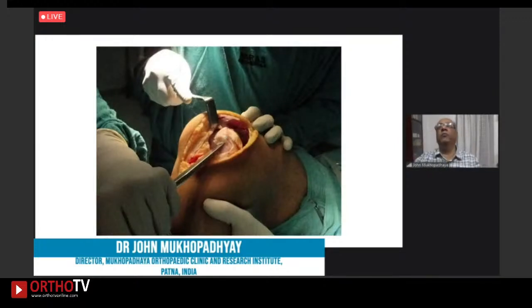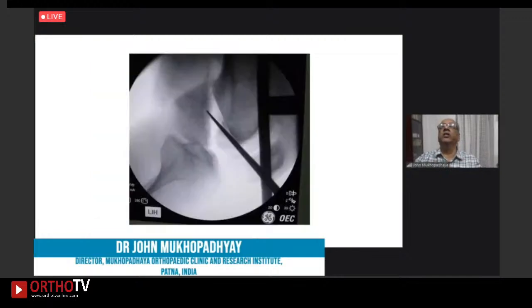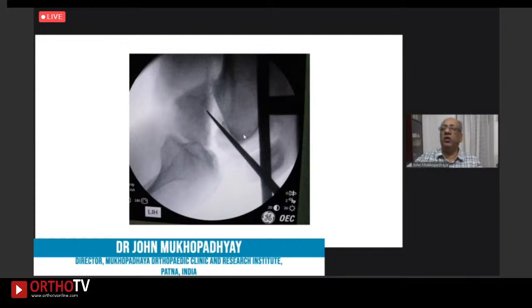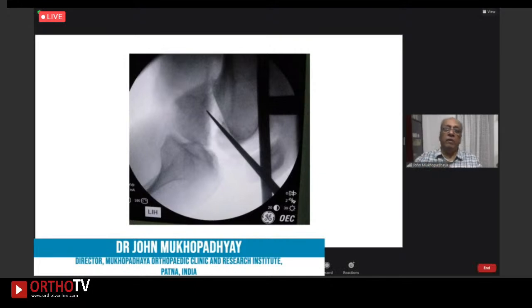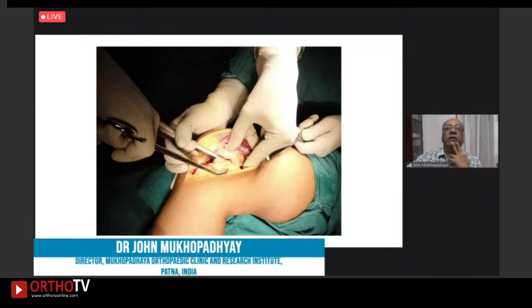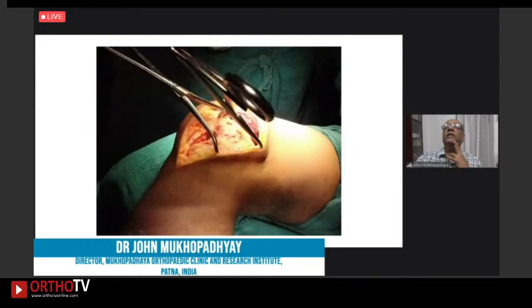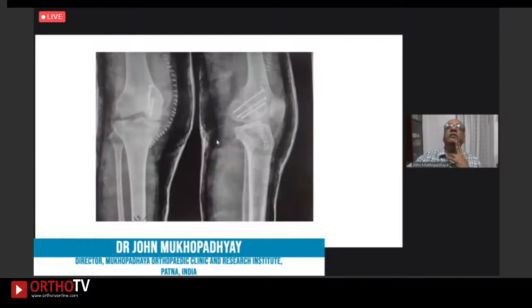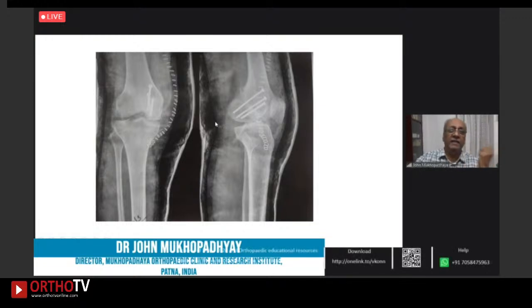An osteotomy was performed through the fracture line. A wedge of callus and fibrous tissue was taken out. Getting the fragment back to its original position was not easy due to the delay, requiring a combination of clamps to pull it, another clamp to hold it together, and levering — maintaining the soft tissue attachment on the posterior fragment. Gradually, adequate reduction was achieved. Fixed with three screws, countersunk and in compression by over-drilling the proximal area. Fully threaded screws with over-drilling are preferred over partially threaded screws.